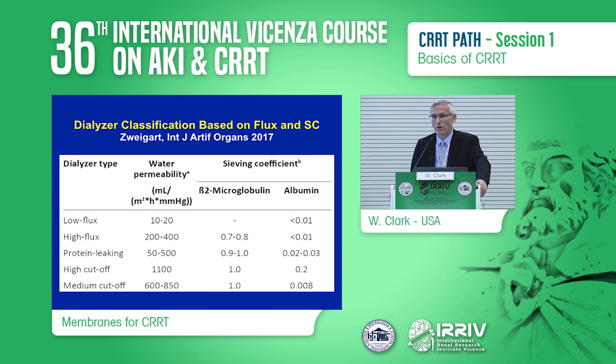Now, taking those things together, water permeability or hydraulic permeability and sieving properties, there have been a series of proposals on the way that filters should be characterized. Again, in the old days, we used relatively simplistic classification schemes. We focused way too much on membrane material, and then way too much on just the water permeability.